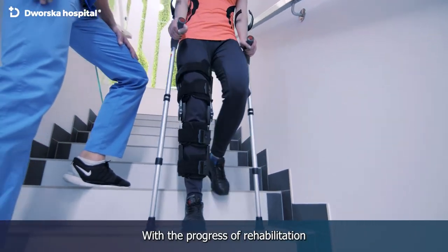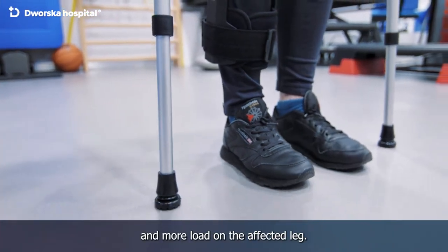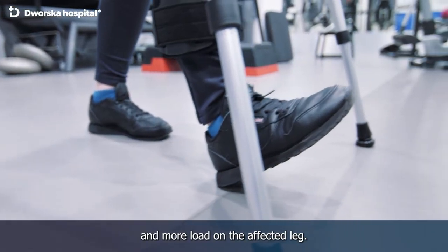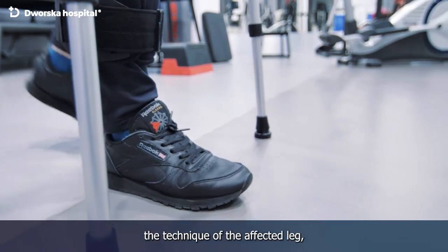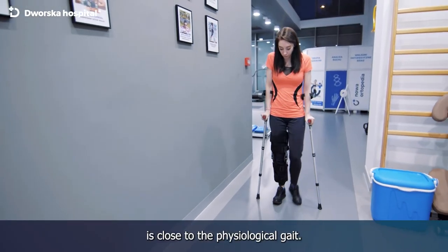With the progress of rehabilitation and after consulting an orthopedist, we put more and more load on the affected leg. We modify the technique of the affected leg so that the gait with crutches is close to the physiological gait.